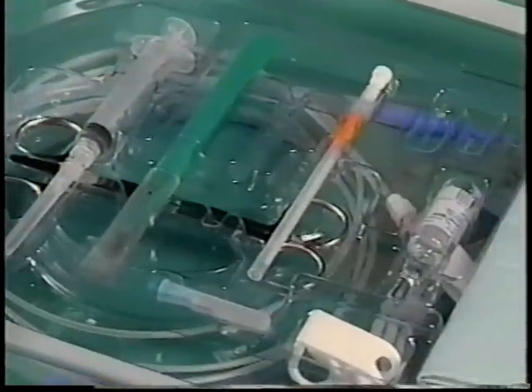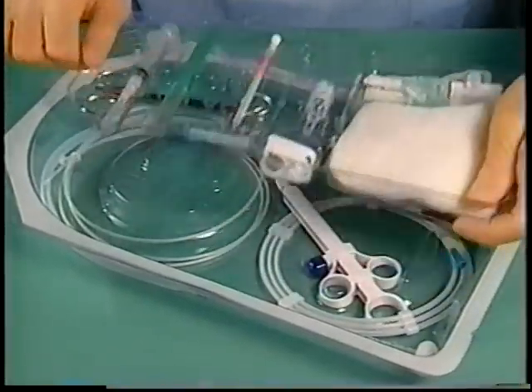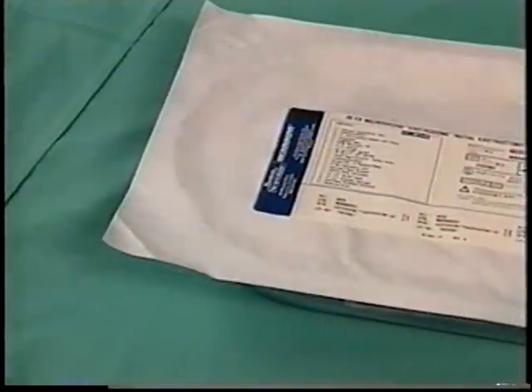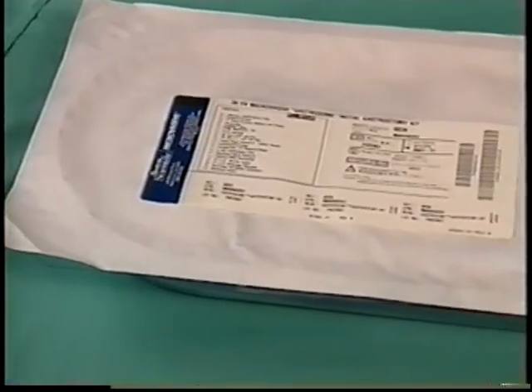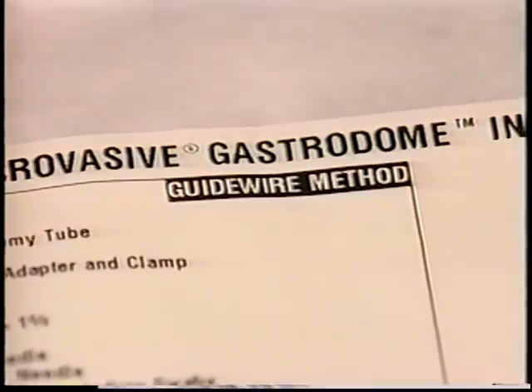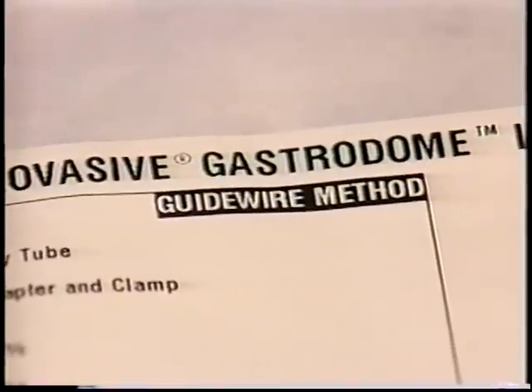The top tier contains items required to prepare for PEG tube placement and finish the procedure. The second tier contains the PEG tube itself as well as the devices needed to place it. There are two techniques for initial PEG tube placement: pull and guide wire. The guide wire technique is also known as the push technique.